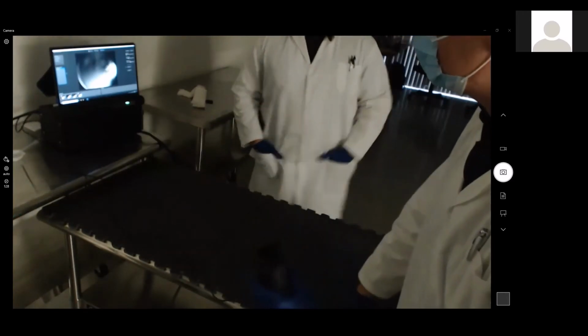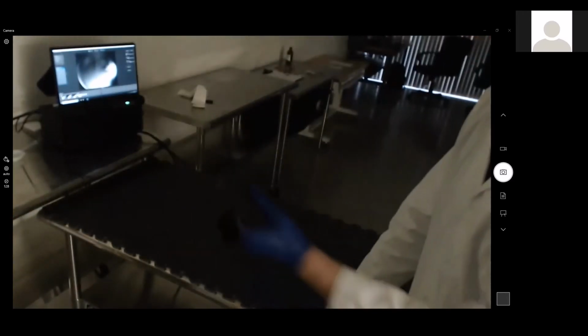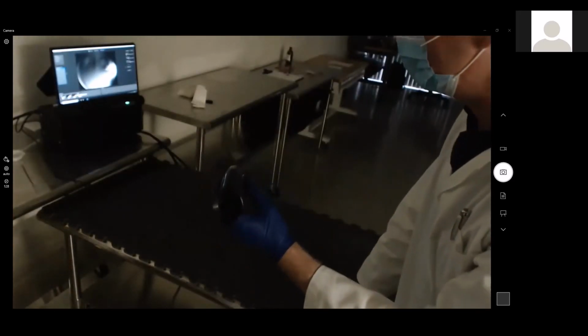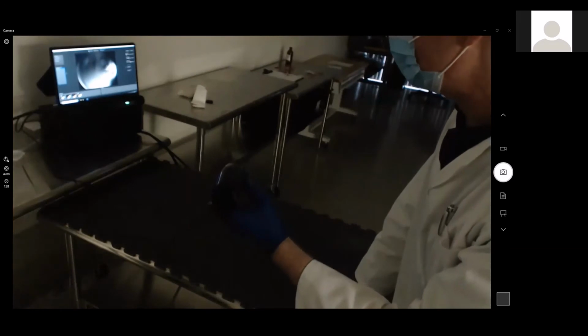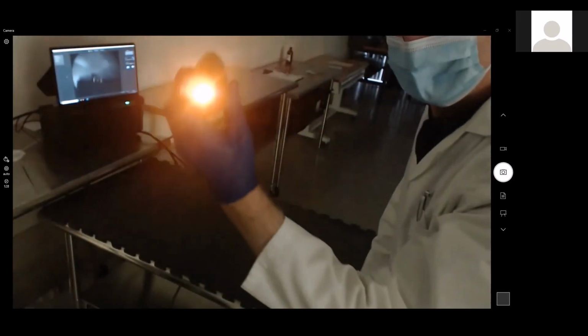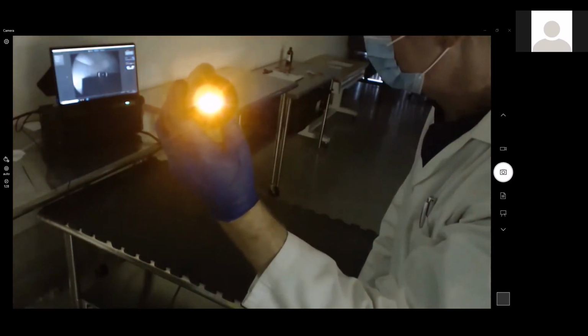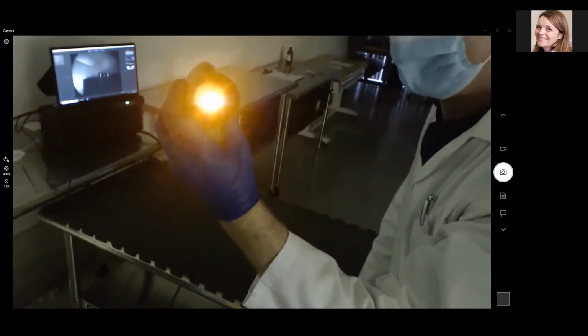Can you turn the light on for a second? Back on here? Or no. I'm sorry, Trenton. No, this light here on the Epicam. Yes, I got it. Sorry, general light. Start it again here. Where did that go? Do you see that light? Yeah, it's too bright. Yeah, it's very bright.